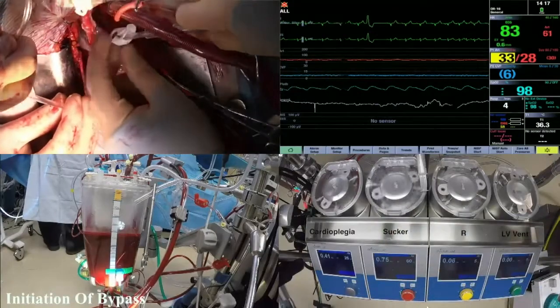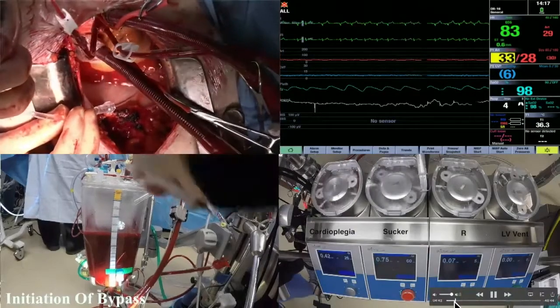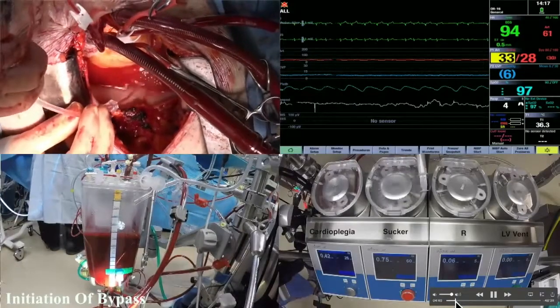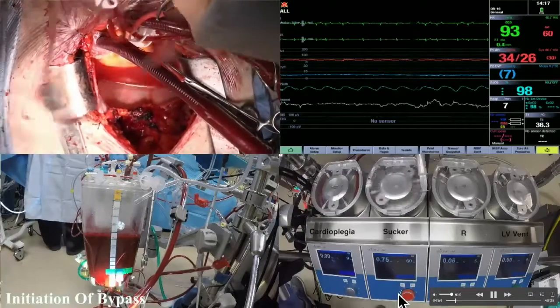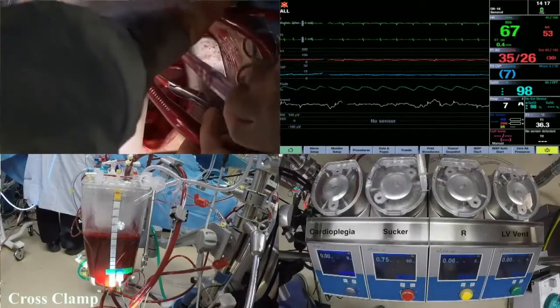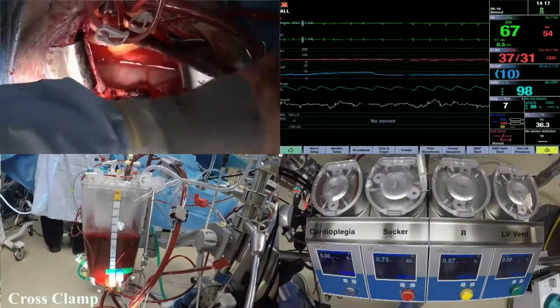In the meantime, David, can you skip on up to when we arrest Mr. B's heart? That might be kind of cool for him to see. 4 minutes, 57 seconds. Let's see here. I'm calling him right now. Calling this number back. So basically, you're on bypass now, but your heart's still working. And we do heart surgery like that sometimes, don't we, Joe? Yes, we do sometimes. But this is exciting stuff.